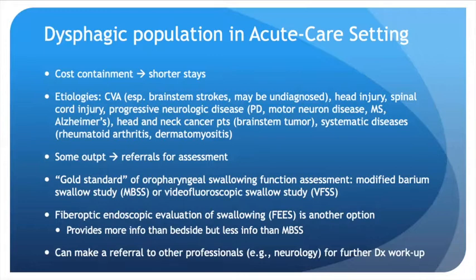You could say that it provides more information than a bedside, but potentially less information than a modified barium swallow study. It can actually provide more information than a modified barium swallow study with respect to laryngeal function. So for example, you could test adduction and abduction of the vocal folds much more easily with a FEES than with a modified barium swallow study. That's not really the purpose of that test. You can also look at mucosal tissue integrity and for the presence of lesions, tumors, abnormal cell growth, that sort of thing.